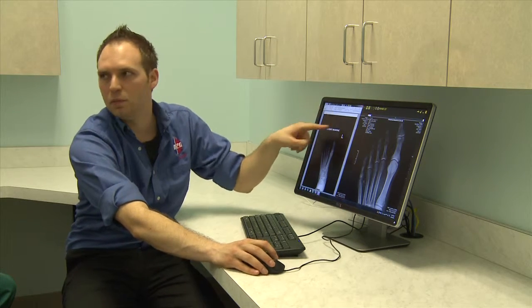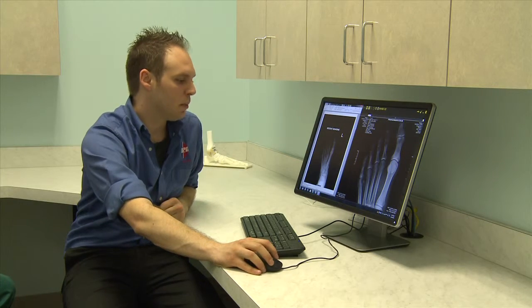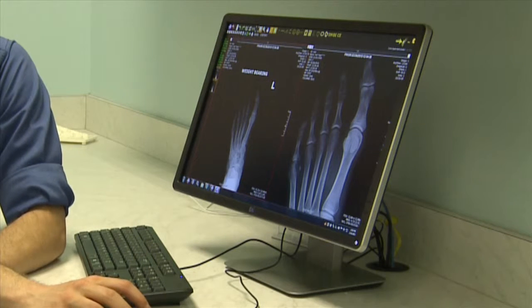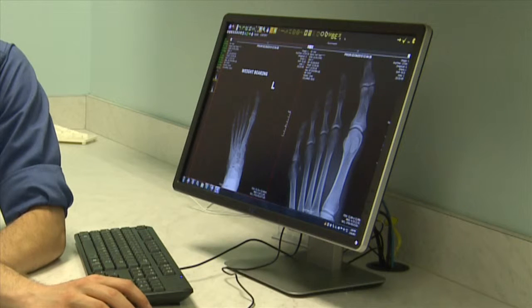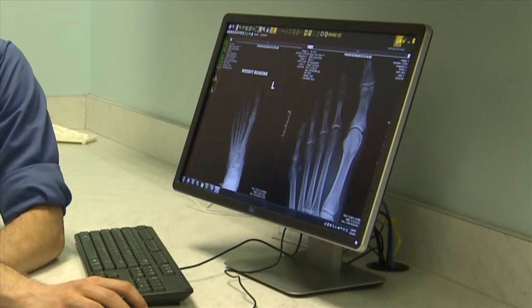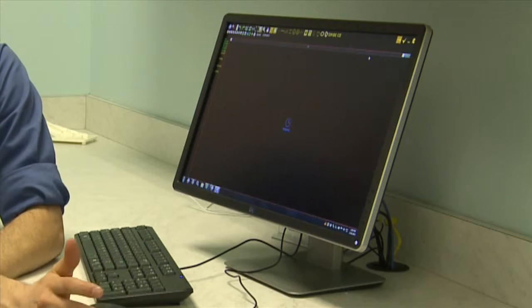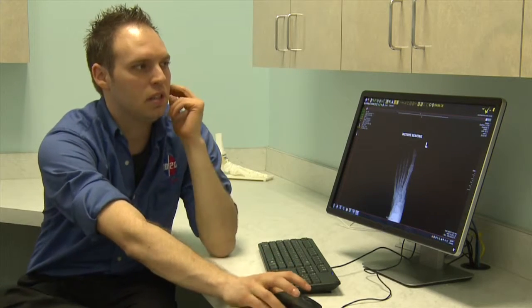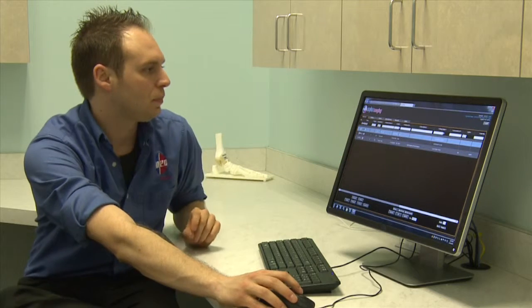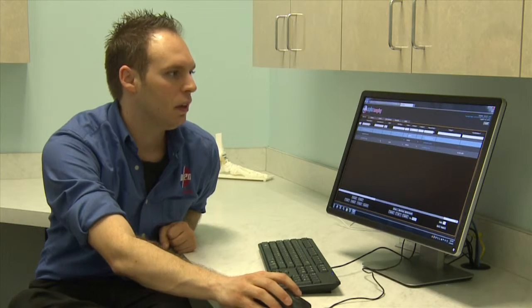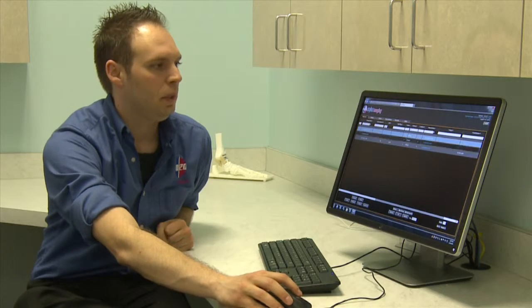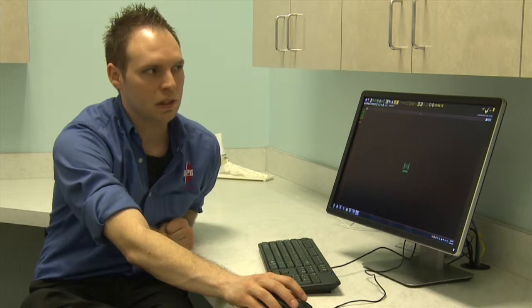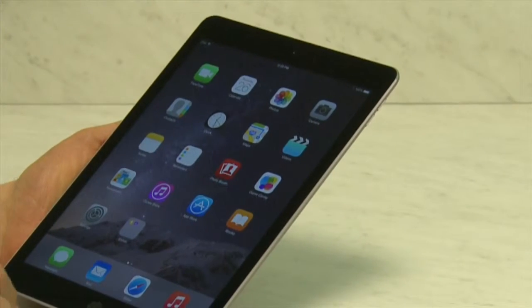The header will show your practice name if it was selected when taking the x-ray, and the footer contains patient information. Up at the top right, Auto Open Next Study will automatically open the next study when you close the current one — more commonly used in radiology. The study status shows as Unread in the study list until you change it or mark it as read.